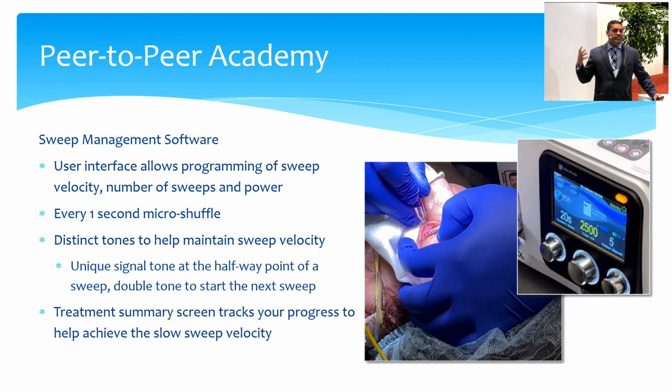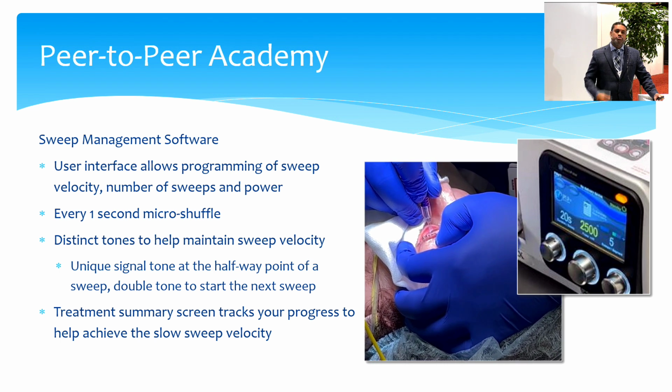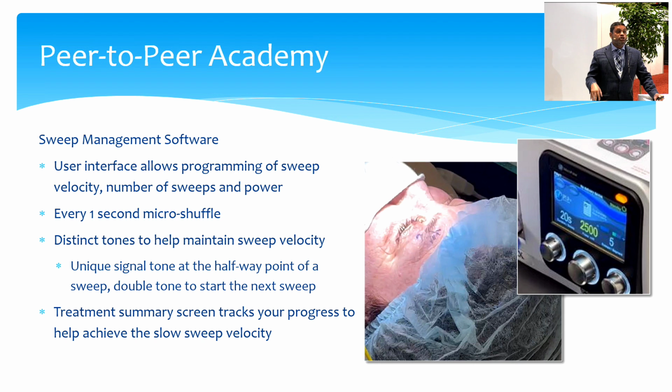That noise, that's the patient moaning. Which is why you do have to do this in the operating room. You really cannot do this, I don't think, in a clinic environment unless you're willing to do a retrobulbar block in your clinic in the absence of much anesthesia. So, like I said before, these folks are receiving propofol. They will kind of moan sometimes in pain, but they won't remember the pain, and you just have your anesthesiologist adjust their propofol as you go.